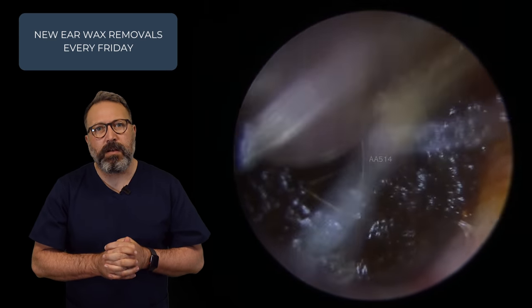I've lost the ability to speak today — it's been such a busy week. There we go — the whole plug. Look at that. Nearly, nearly... there it is. So you can see just how long that piece was — it practically covered the entire canal wall. Eardrum looking lovely and healthy there. Just going to tidy up — look at the dryness of it there when it came away. You can see how it forms that outer sleeve of dry skin around the outside edge, but looking much, much better. Now we've got that offending piece of wax away, the natural migration processes can carry on in the ear, because the ear is constantly trying to expel wax. Unfortunately, when you get these blockages forming, everything's just backing up behind it and doesn't quite get out. So that was the patient's first ear — this is the other ear now.